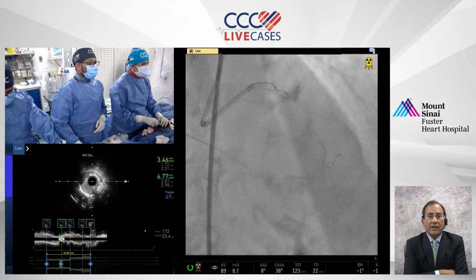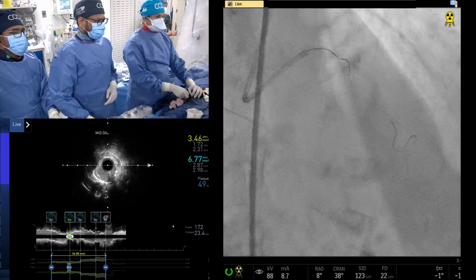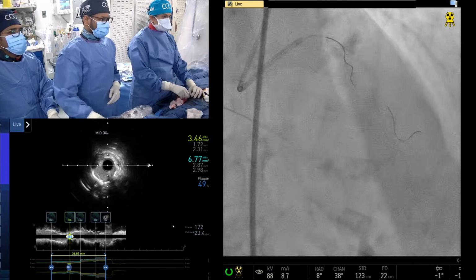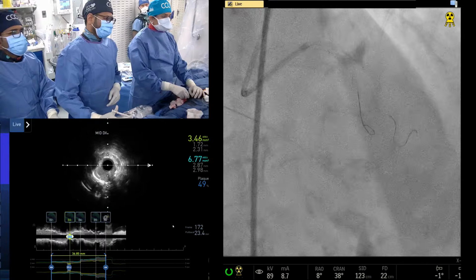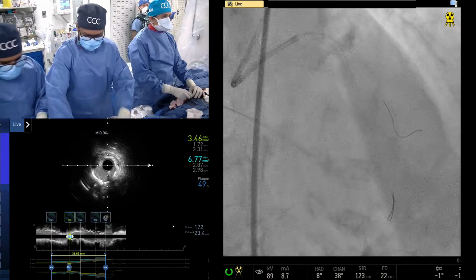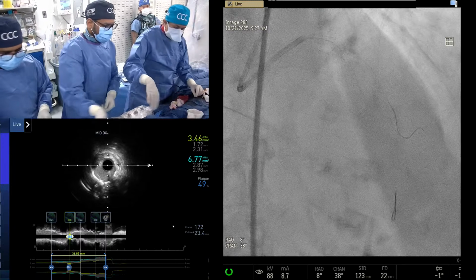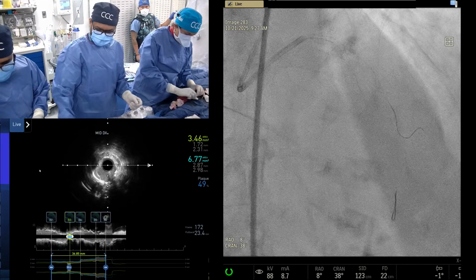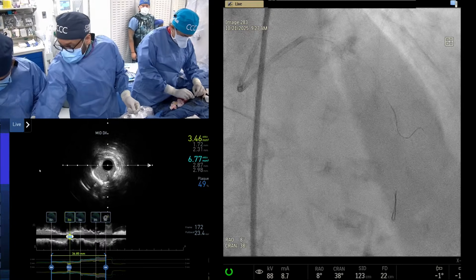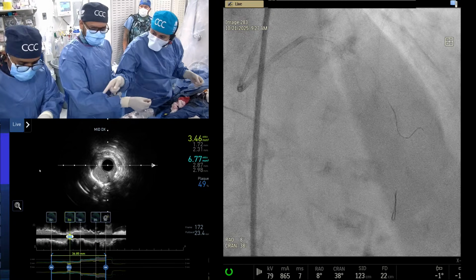Yeah, no, that is true. Some studies have shown that in the past, but the majority of them have shown it, and particularly we have it with post-procedure MI and troponin elevations. The only thing is that this one was CKMB, and they call it a myocardial injury. They didn't call it MI because many of these cases did not meet the universal definition 4A, which requires the patient to have chest pain, EKG changes, and MB elevation.